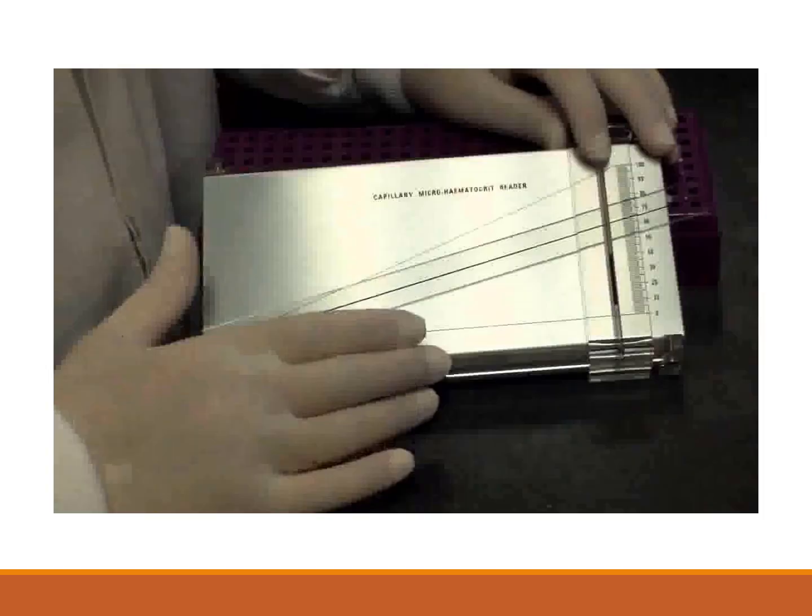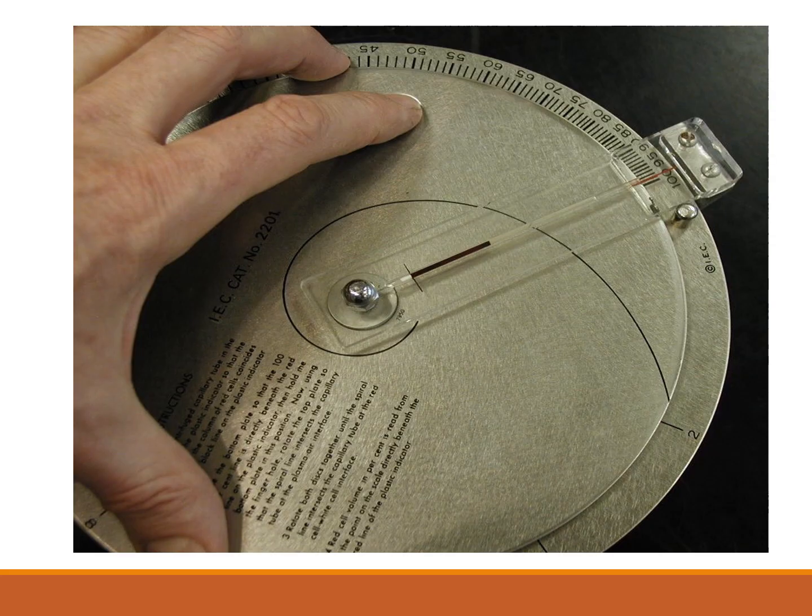In this slide, the rectangular reader is being used to determine the results of the hematocrit of a certain patient or individual. Later on in the video demonstration on how this activity is performed, you will be able to know how this device is correctly or properly used. The same goes with the circular reader, which is another device to determine the hematocrit result of our patient.